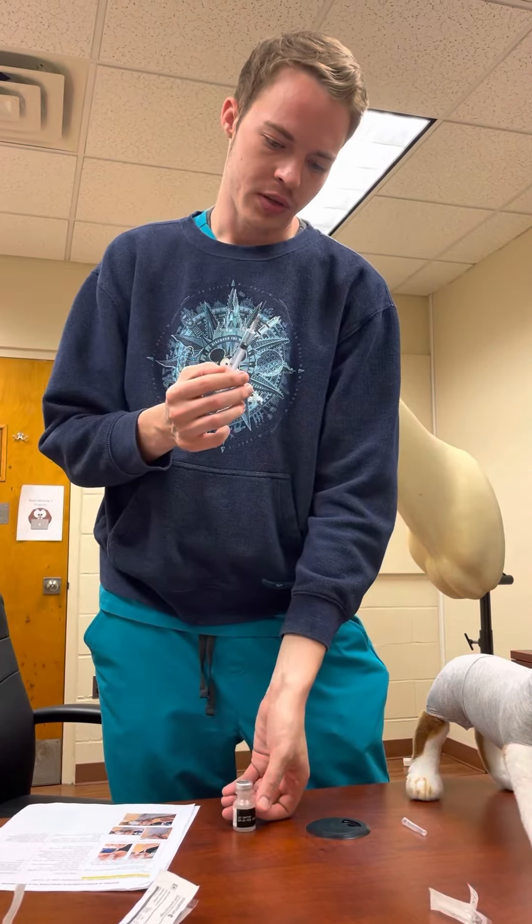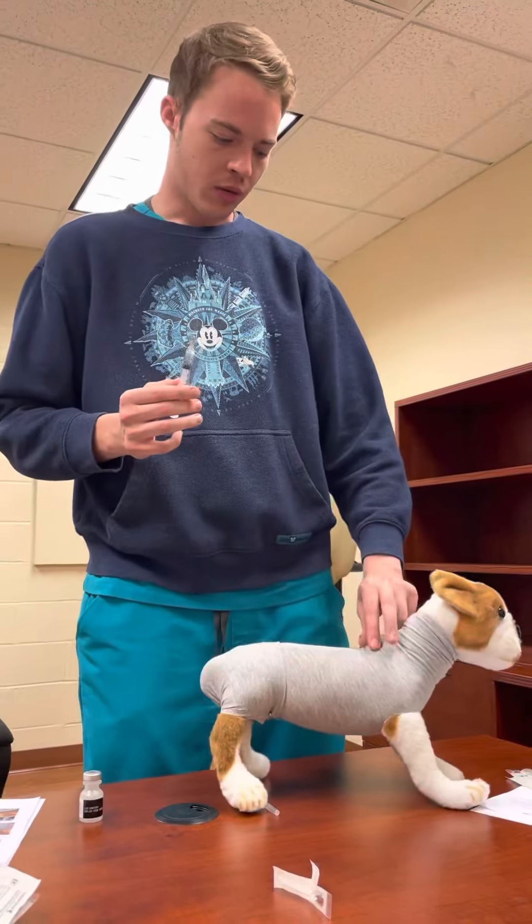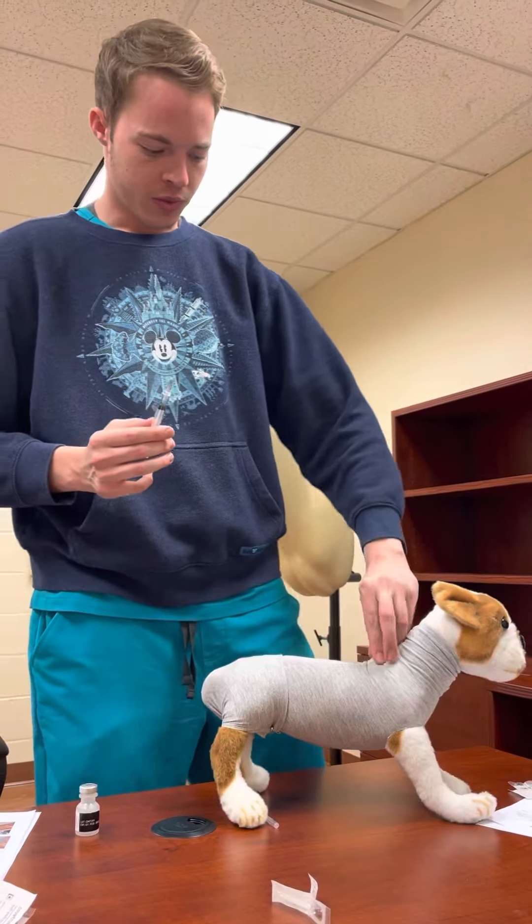After we do that, we need to tent the skin on the patient. We're going to use our non-dominant hand — our pointer finger, middle finger, and thumb — to make a tent.